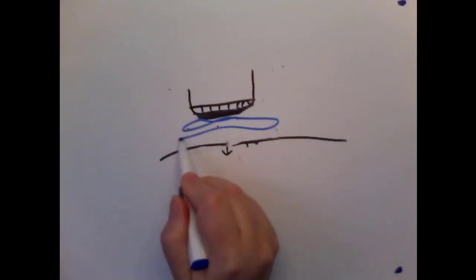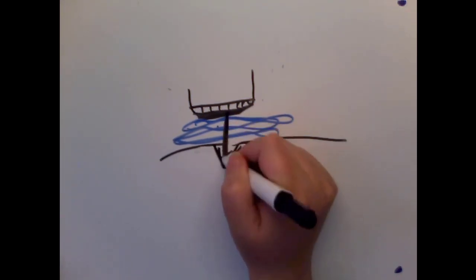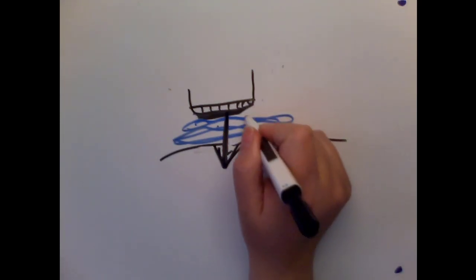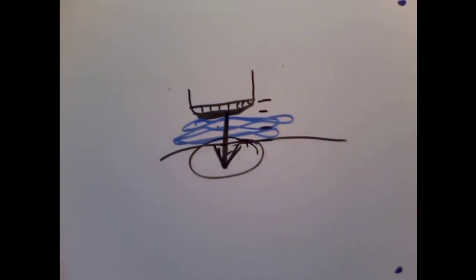Now we have this layer of gel in here. There's no air, just this water-based gel, and that's going to make most of our sound go right into the body. So that gel helps us to direct the sound into the body. It has a similar impedance to the skin. So again, we're matching impedances through these layers as best as we can to get the most amount of sound into the body.